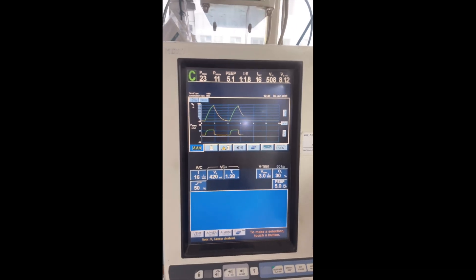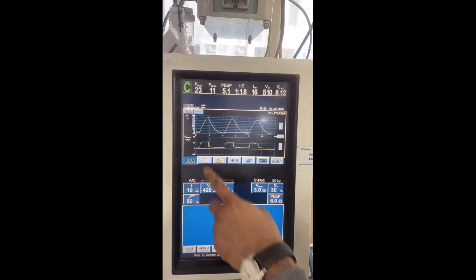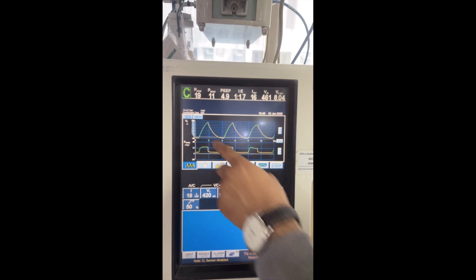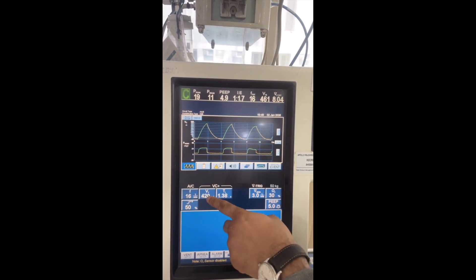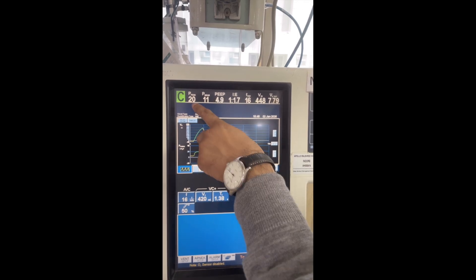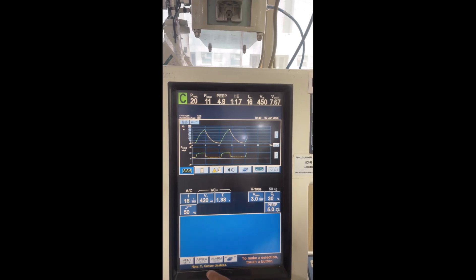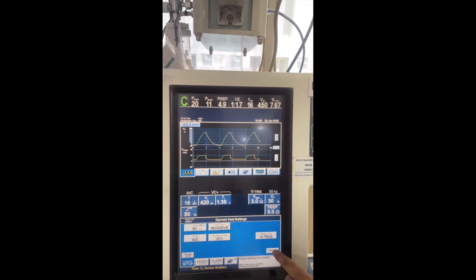Now what will happen? This is VC Plus mode. Now for this tidal volume, this pressure will vary and the ventilator will try to deliver the tidal volume. Now it is coming high, so it will slowly drop the pressure. Now you see it's coming to 20, then it will further drop.